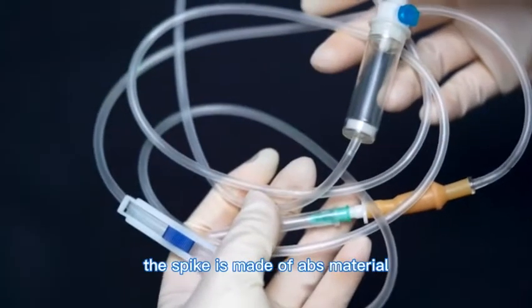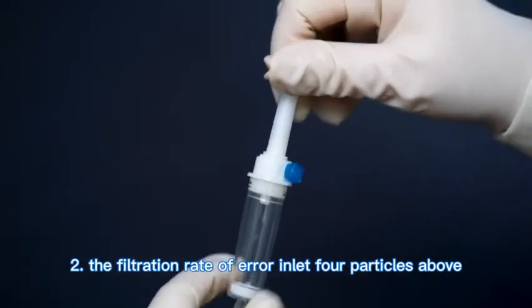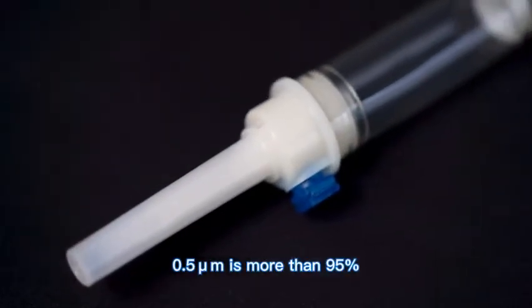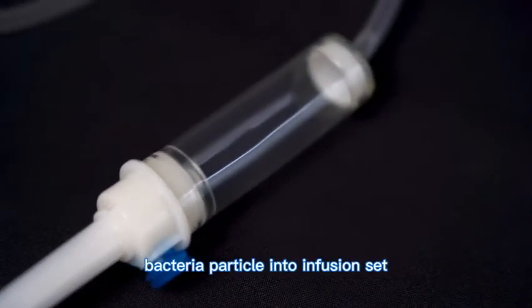1. The spike is made of ABS material and is easy to puncture. 2. The filtration rate of the air inlet for particles above 0.5 µm is more than 95%, effectively prohibiting bacteria and particles from entering the infusion set.